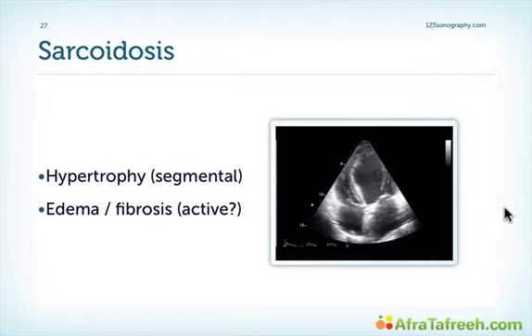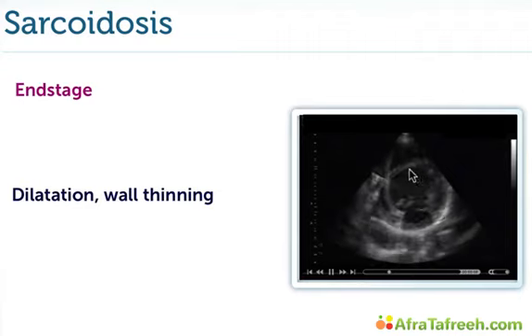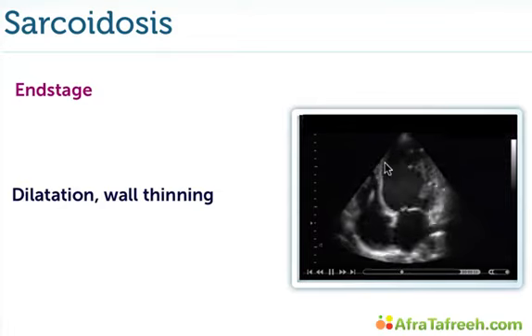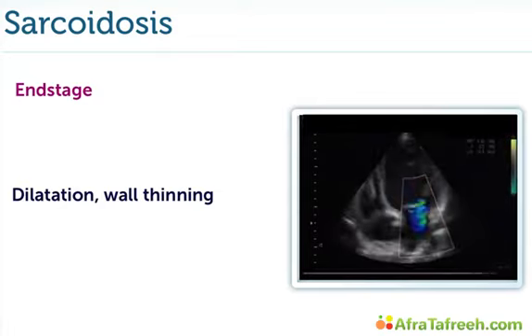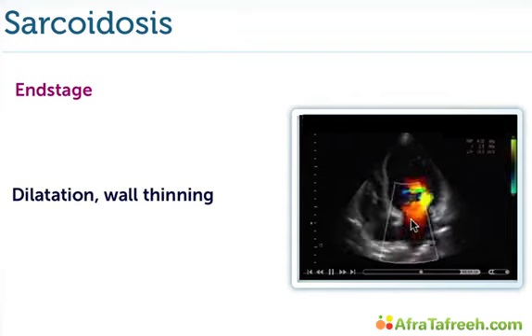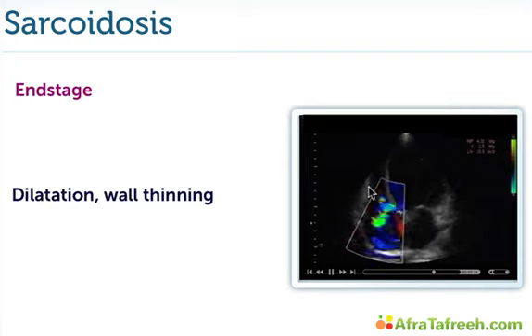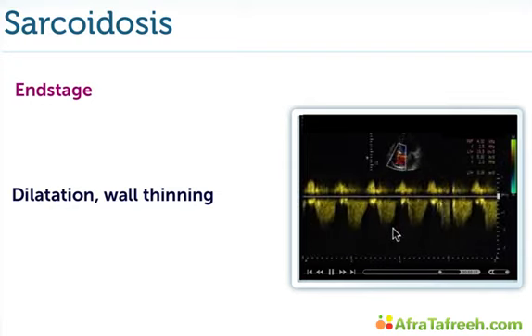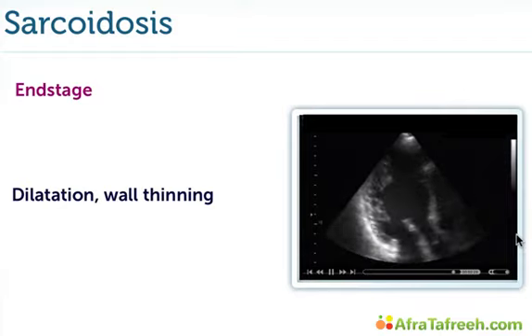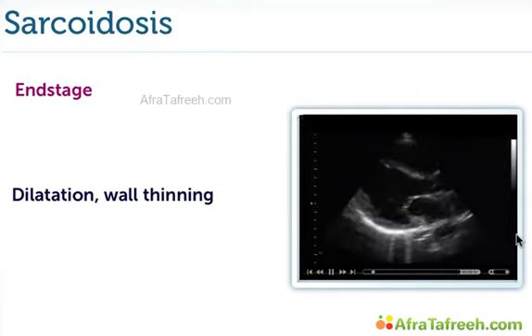Example of a patient in the end stage of sarcoid heart disease. You can see the patient has severely reduced left ventricular function with a very thin septum, very similar to a patient who also has dilated cardiomyopathy, some degree of mitral regurgitation and also aortic regurgitation. The patient also has a pacemaker because of conduction abnormalities and significant tricuspid regurgitation with pulmonary hypertension. So in the end stages, a very severe disease, and this patient actually died only shortly after this echocardiogram.